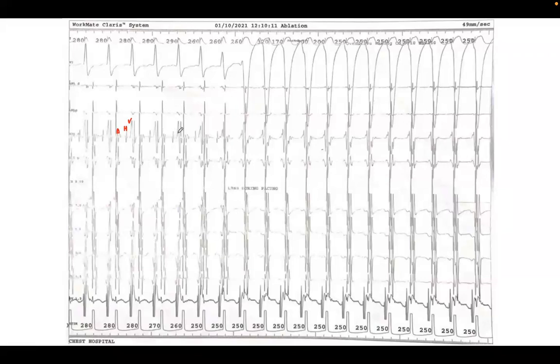The AH prolonged a little bit. Yes, the AH prolonging, this is expected, right? This is normal. You're pacing fast, so you're coming down on your atrial pacing. That's normal. However, A, H, V, and then now look at this. A, you see maybe V before the H. The H is hidden now within the V. Plus, you see widening of the QRS. But like we said, there is AH prolongation and HV shortening. That's a sign of what?